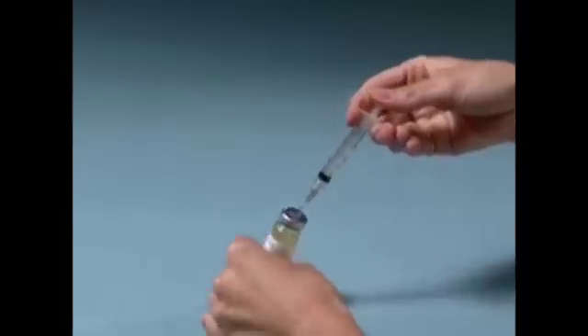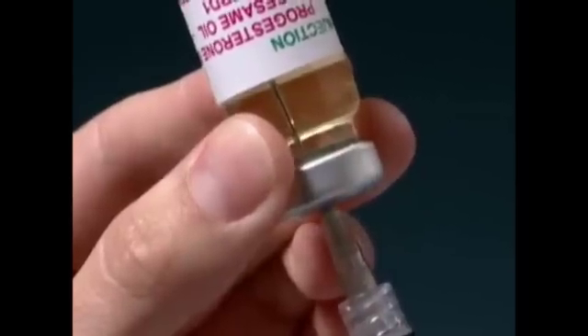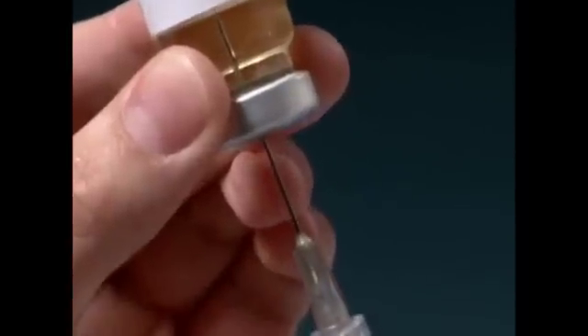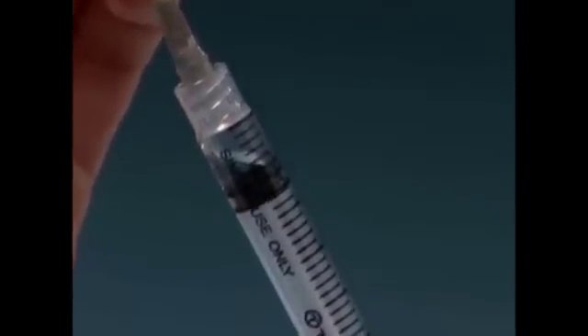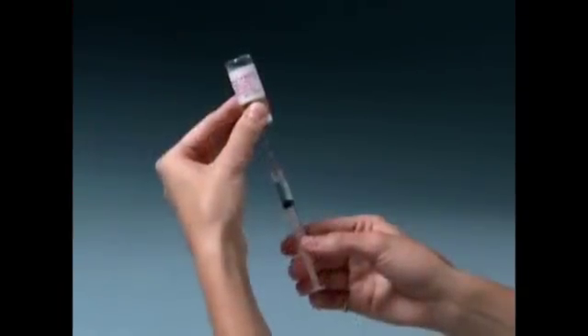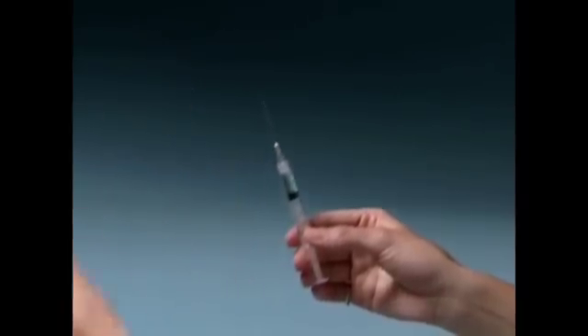Without removing the needle, invert the vial and slowly pull back the needle as far as needed to withdraw the milliliter cc dose of progesterone in oil that you've been instructed to take. Make sure the tip of the needle remains in the liquid by slowly backing the needle out of the vial as you withdraw the solution. You will only be using a portion of the medication for each injection, not the entire vial. Remove the needle and syringe from the vial.